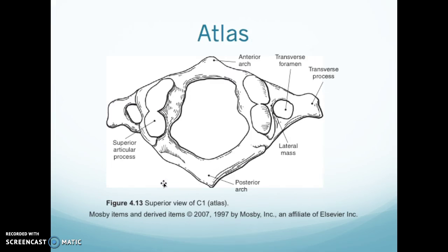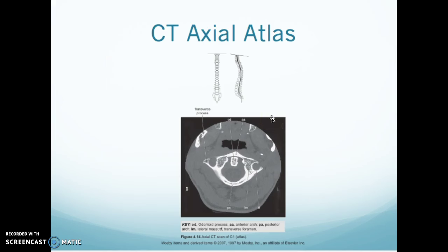This is C1, the atlas. You have your anterior arch with your posterior arch, your transverse process with your transverse foramen within it, your superior articular process up top, and your lateral mass between the transverse foramen and the superior articular process. On CT you can see your anterior and posterior arch, and then the lateral mass is larger here with your transverse process and foramen.